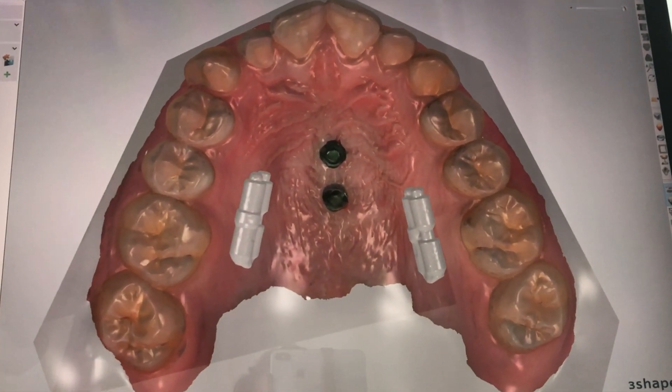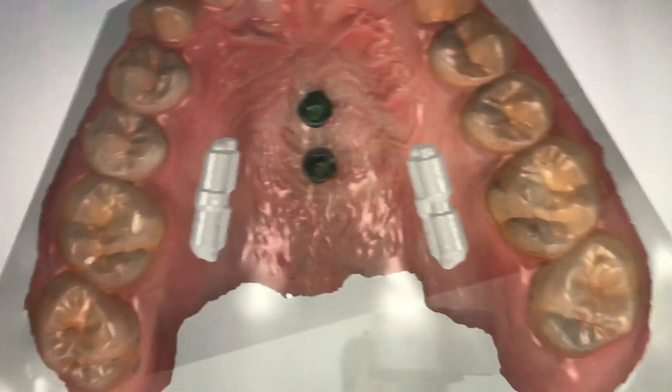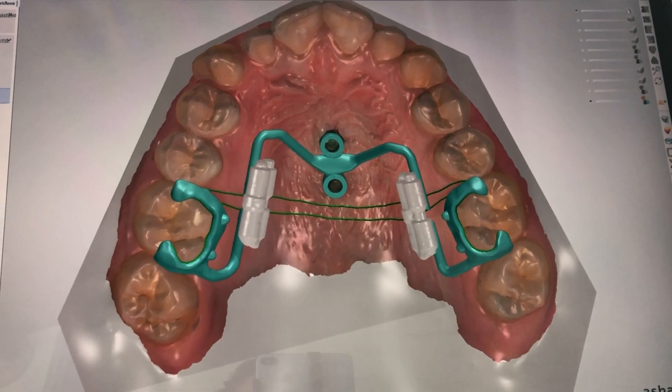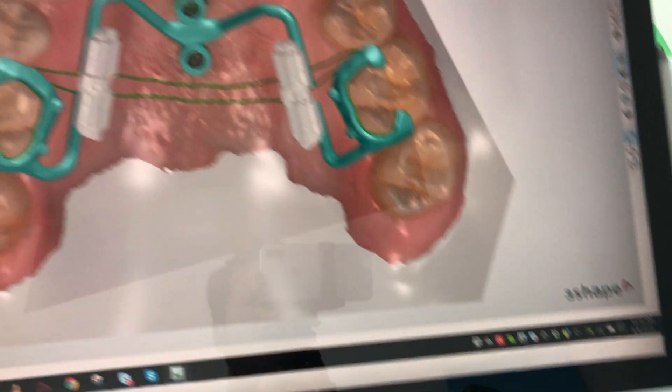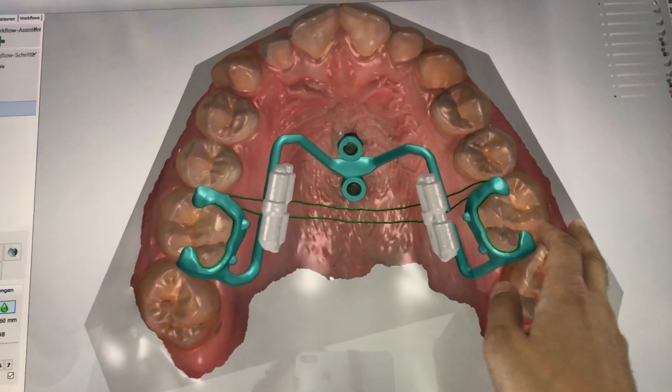From the scan, you have to scan the implants, you add the distalization screws, as you can see, and then you make a virtual design. You can do it with 3Shape for sure, but you can also use Exocad, Meshmixer, Blender, or whatever software you like.